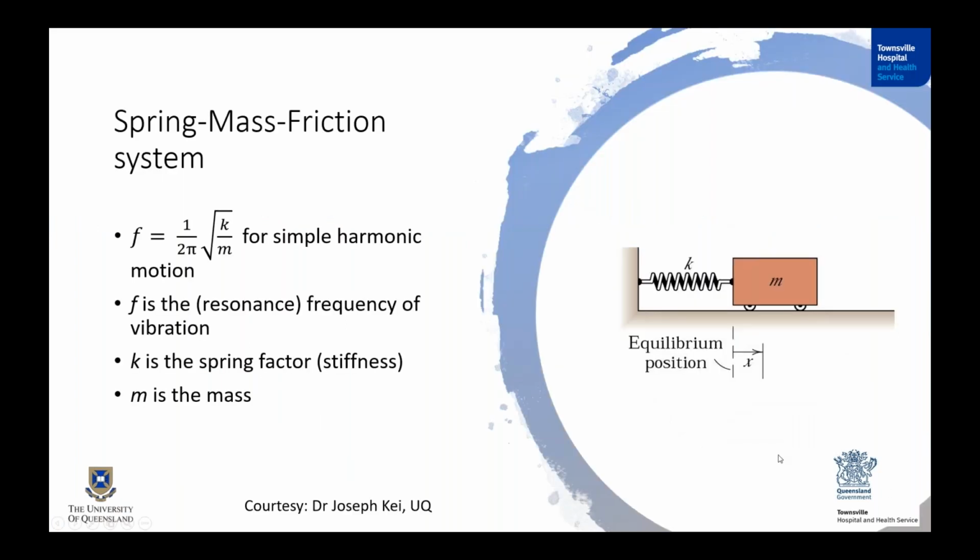If you look at the resonant frequency, as the stiffness increases, more of the low frequency energy gets reflected, and as the mass increases, you can see that the higher frequencies get reflected. So this is the basic mass spring function of the middle ear system. The friction component doesn't act so much for the wideband absorbance as the spring and the mass components.